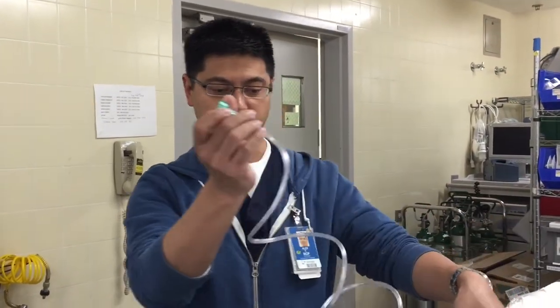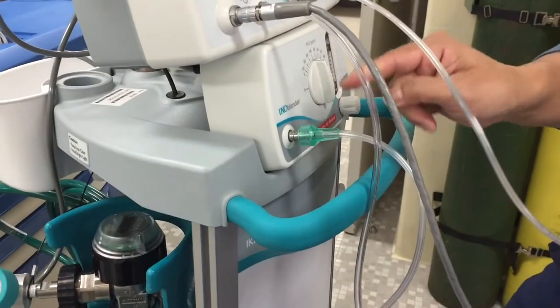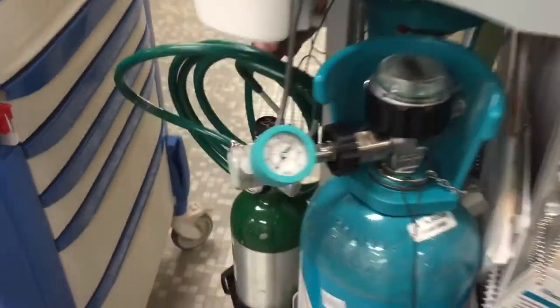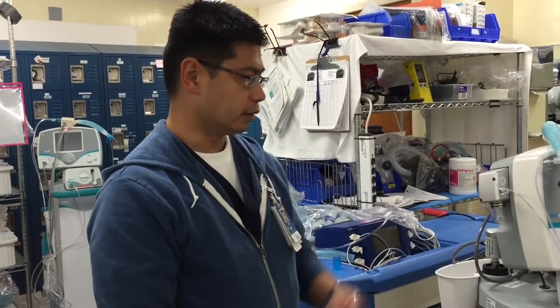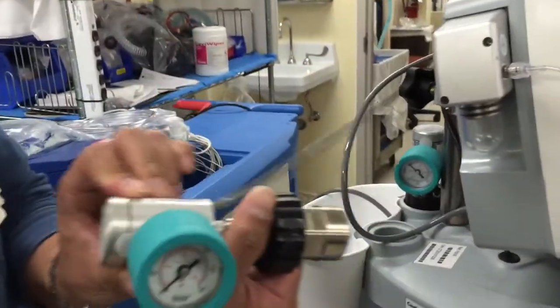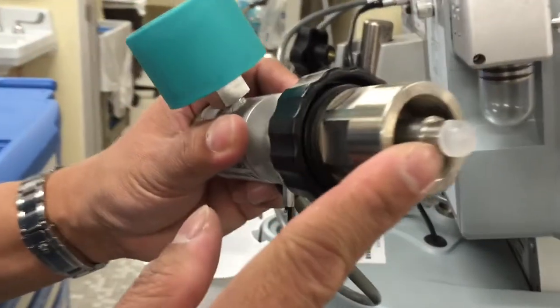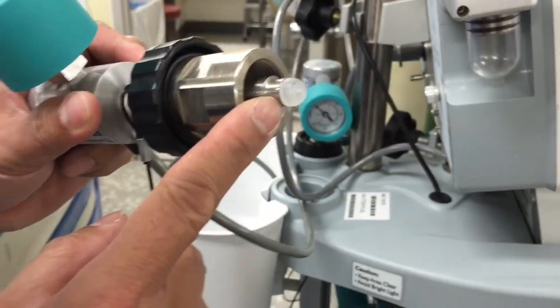Other than your oxygen tubing, you have to connect that to your iNO blender, or just an O2 source in the back. Now we're going to do part of the pre-use check. The main thing is that you want to make sure that your iNO regulator has that plastic tip on the end, because otherwise your tank will leak like crazy.